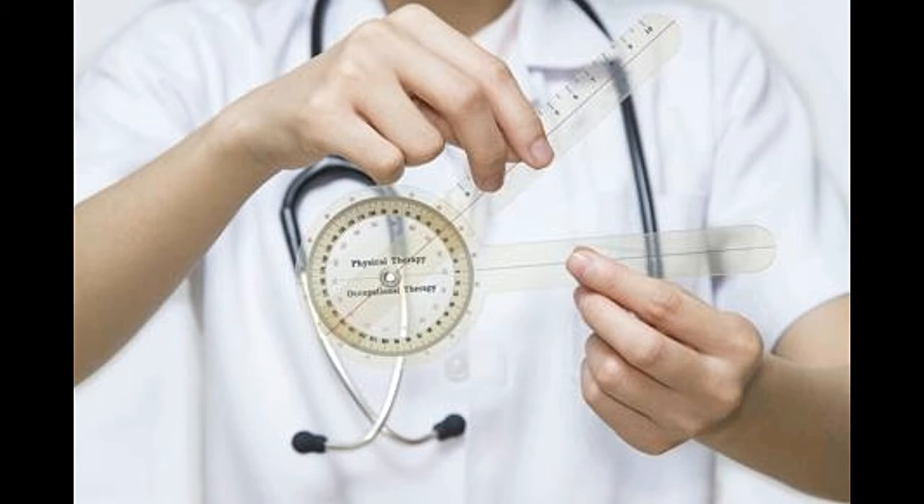Goniometers are mostly used by physiotherapists or orthopedic doctors to detect irregular joint movement. Ergonomists use this scale to measure a specific joint angle associated with a certain task. This helps them design equipment more precisely, such that it suits the posture of the person using it.